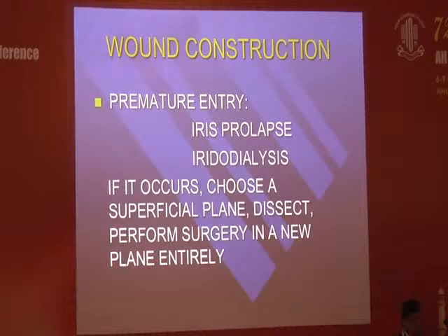So there is one wound which is blackish in color, I think the incision. First of all, do one thing: suture that blackish color without doing anything. Once you suture that, then you can go ahead and do the tunnel in the same place. But if it is not possible, first change the side and suture the previous one. If it is not possible on that side, then go slightly up from whatever incision you have taken and make a superior tunnel. It is a thinner superior tunnel and the lower part you should suture.